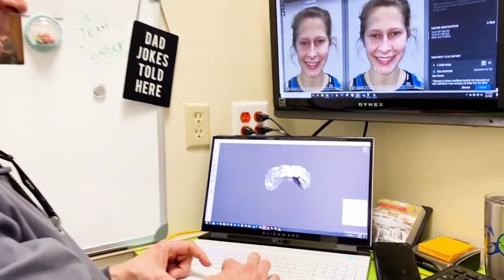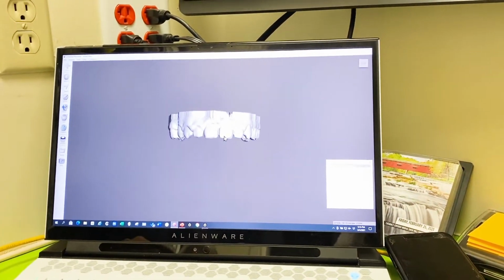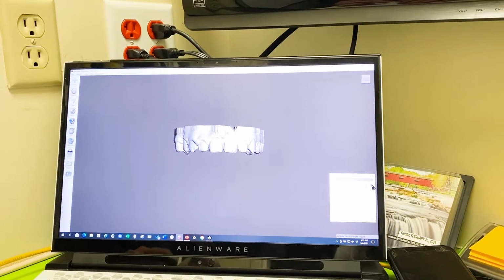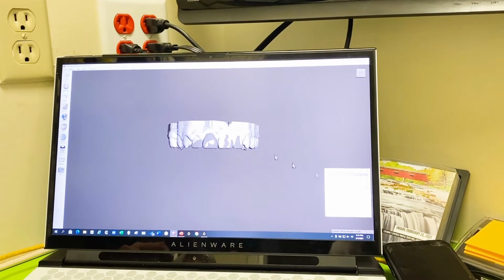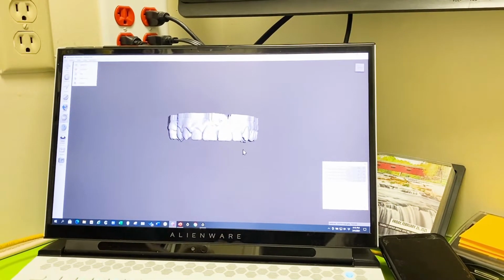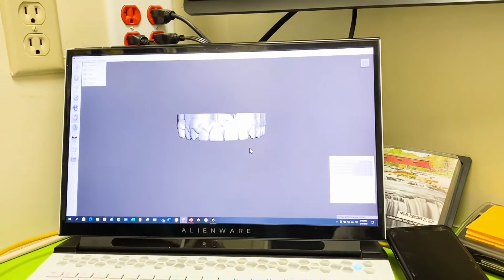So here's my STL in the Mesh Mixer software. What I've done when you weren't looking is I imported the STL of some teeth and moved them around until they were in just the right position. You can see I basically just put pontics over these teeth. Once you get them to the right spot, this will help you visualize the position of the teeth and also the shape and size of where they should be.